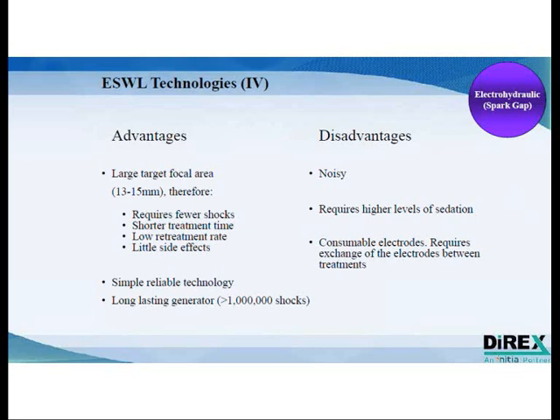You will have thus a lower retreatment rate, lower patient comeback, and you will have fewer side effects because, of course, you're causing less damage to the soft tissue. It's a very simple technology, a lot of experience, and also the generators last a very long time with this technology. The disadvantages are that the spark causes a lot of noise and also requires high levels of sedation.